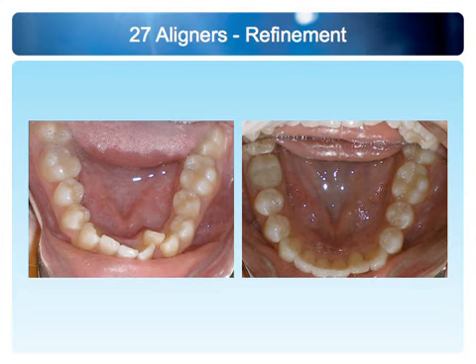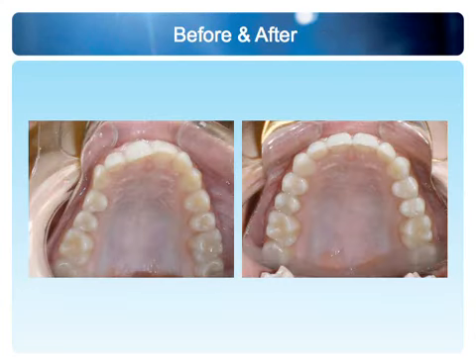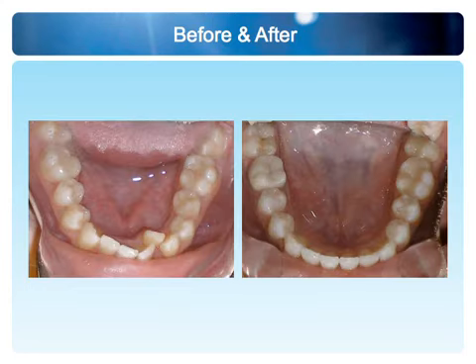But you can appreciate the amount of premolar movement, because these teeth were turned and leaning in, and they are now upright and derotated. And the same thing on the posteriors. How far these teeth were leaning in versus how they are standing tall now. And so, as we upright these posterior teeth, the final set of photos looks like this. We know the upper arch was completed at aligner number 11, but the lower arch looks like this.